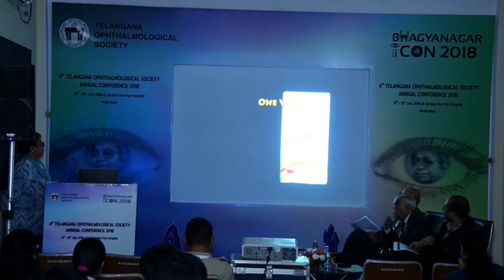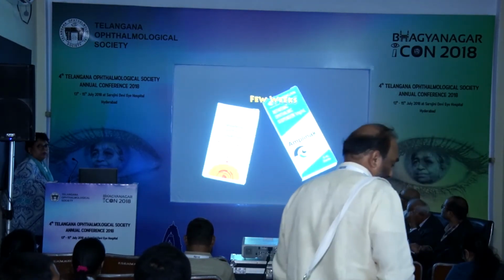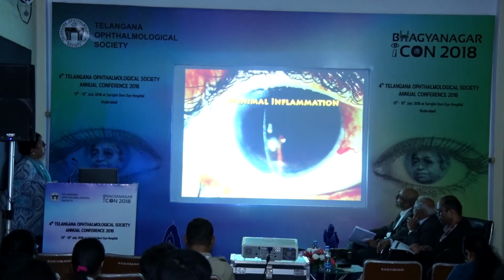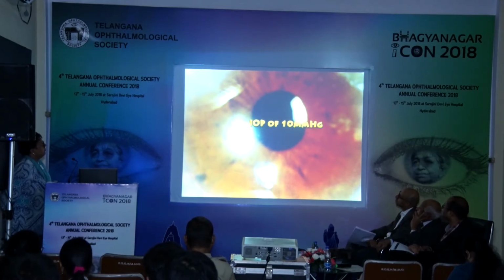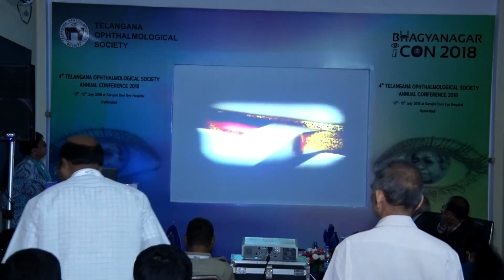Post-operatively, the patient was advised antibiotics for 1 week, steroids in a tapering dose, and NSAIDs for a few weeks, and all pre-op anti-glaucoma medications were discontinued. Post-operatively, his eye had minimal inflammation and no hyphema was seen. One year post-surgery, he had a visual acuity of 20/20 and N6 best corrected, and an intraocular pressure of 10 mmHg without medication. Thus, a simple, safe, and elegant technique resulted in a favorable outcome for our patient.